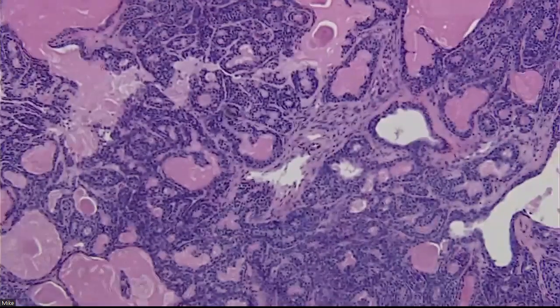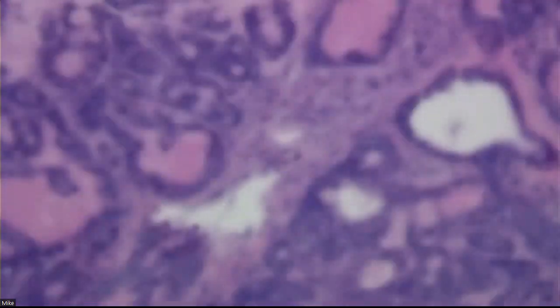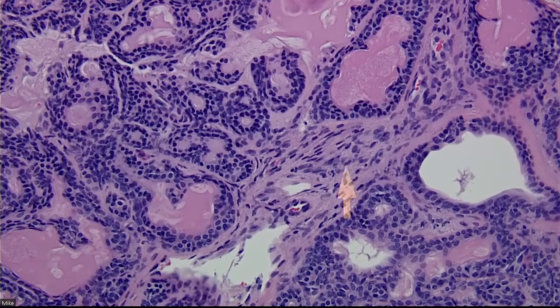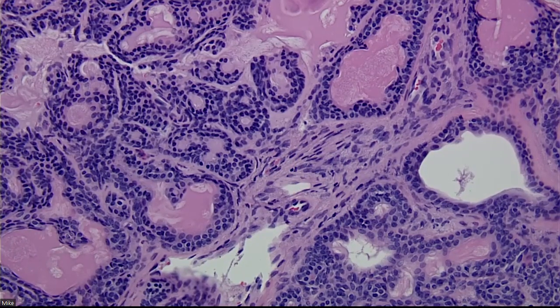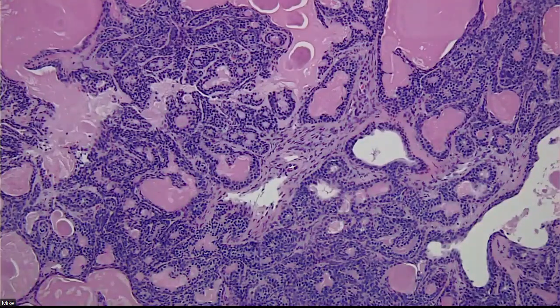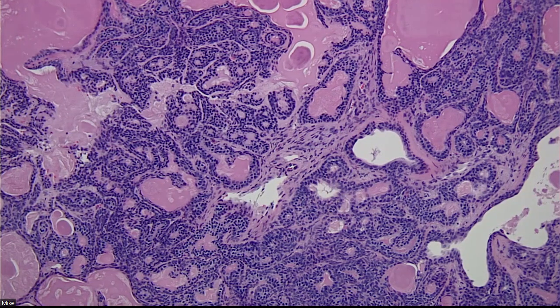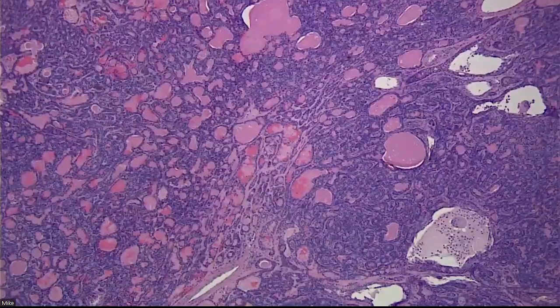Between the epithelial cell islands, can you see in areas there are these spindled cells? You will not find that chondroid or chondromyxoid stroma, but you will find a fibrocellular stroma, sneaky and subtle in between the epithelial islands, which is really characteristic of a basal cell adenoma. And it stains strongly for S100.